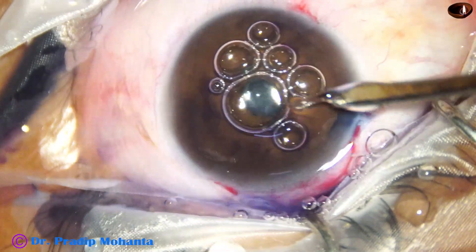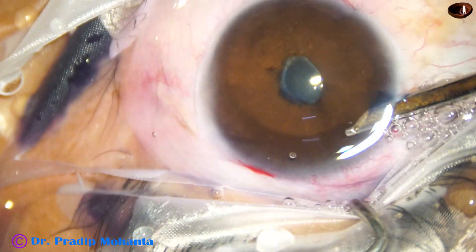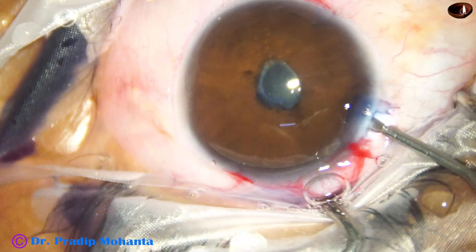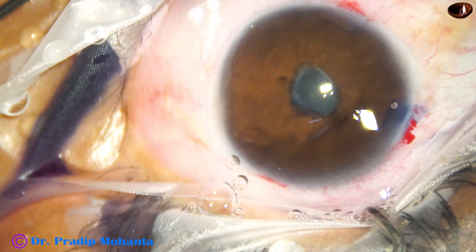Now, this is adrenaline, though it will not cause any effect. And now the dye is washed out. Now 2% HPMC is used to fill up the anterior chamber.